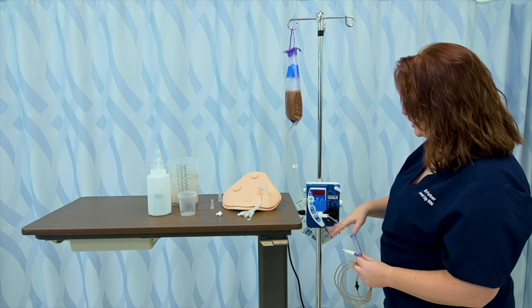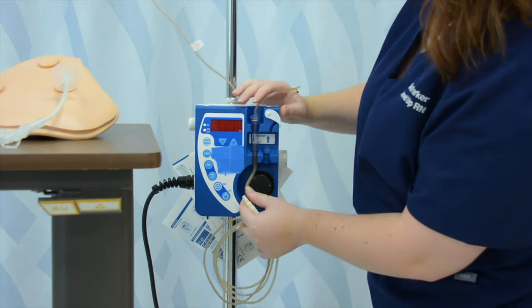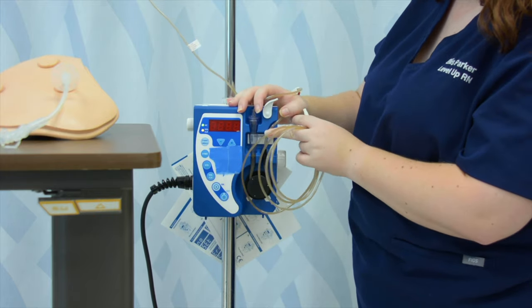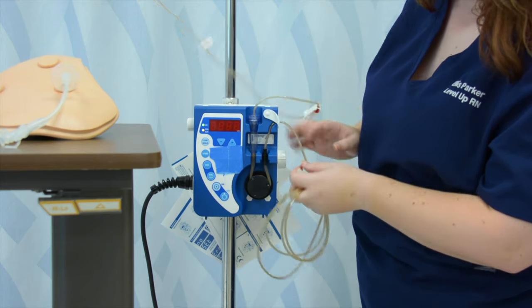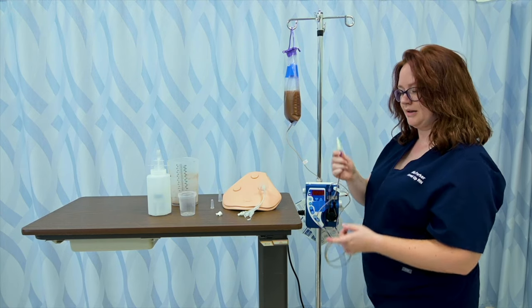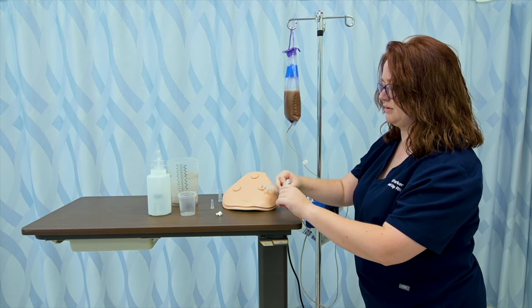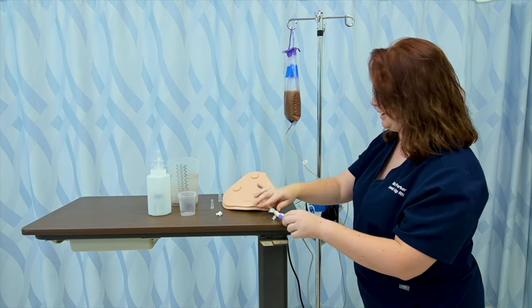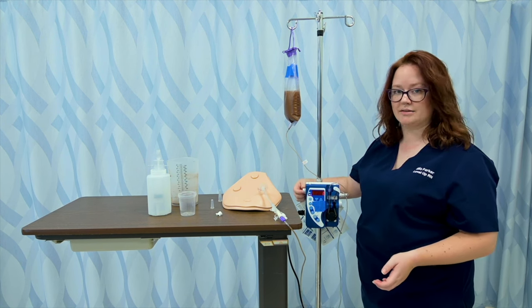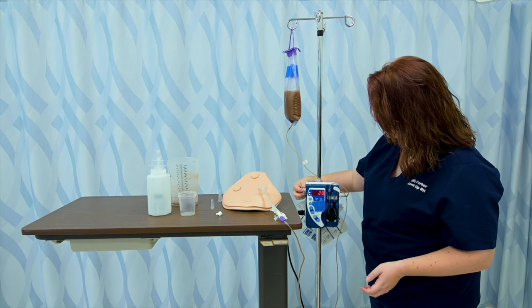Now with the pump — I've already turned it on — I'm going to place the drip chamber in, loop the stretchy tube around, and drop that black piece into the hole. Then I can place the tubing here, which helps make sure this part doesn't kink off or bend. Then I'll put the end of the tube into the patient's port, removing their cap and making sure it's nice and secure. There's a dial on the side to set the rate — we're going to go with 20, meaning 20 milliliters an hour.